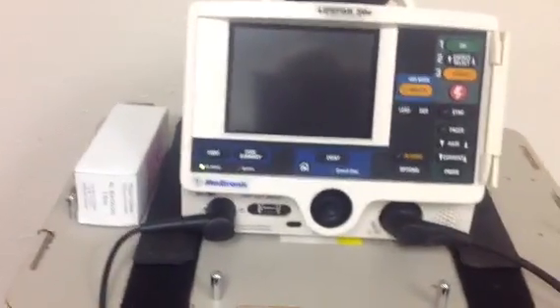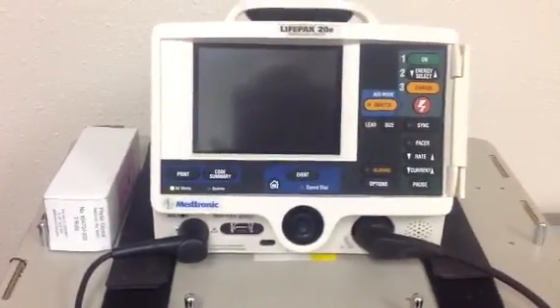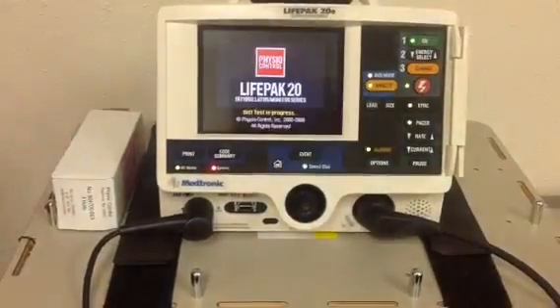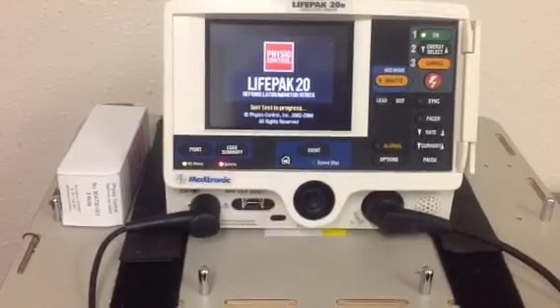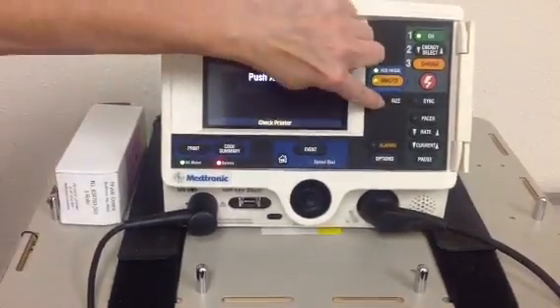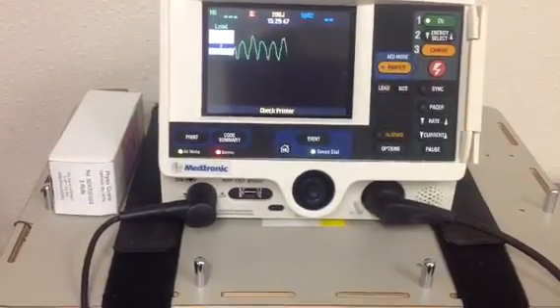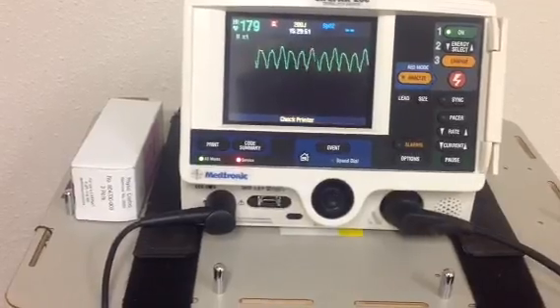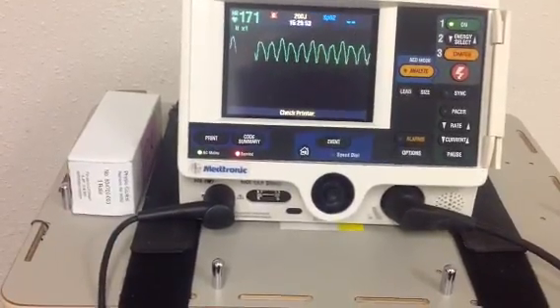So back to our monitor here so you have some sort of idea of how to operate this. First of all, you've got to turn it on. Just push the green button and it's going to tell you what to do. Notice it has an AED mode and it also has a lead mode. You can select either one. Right now we are in the lead mode.